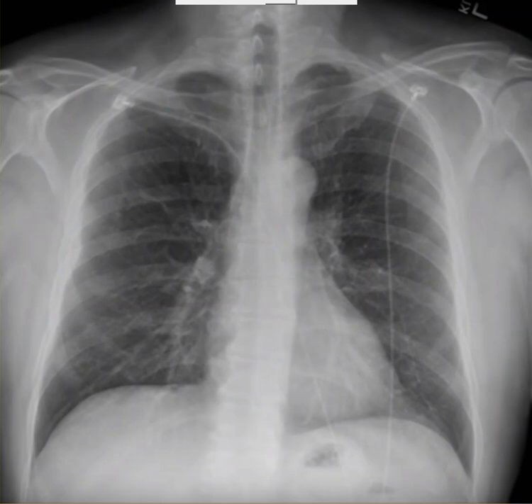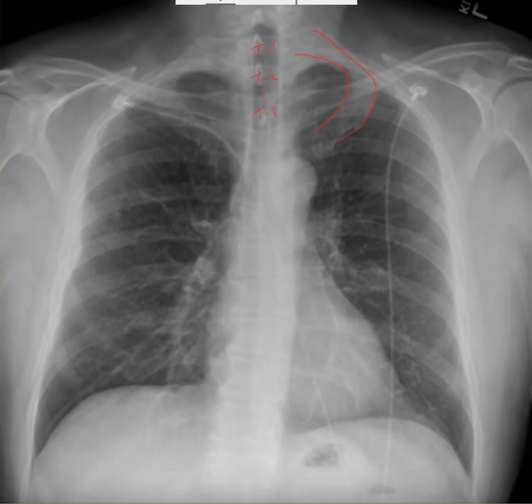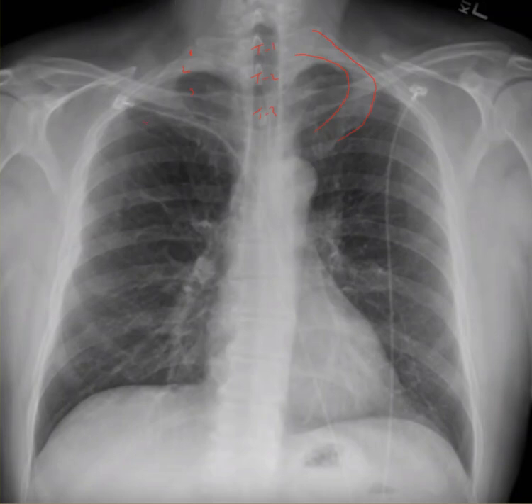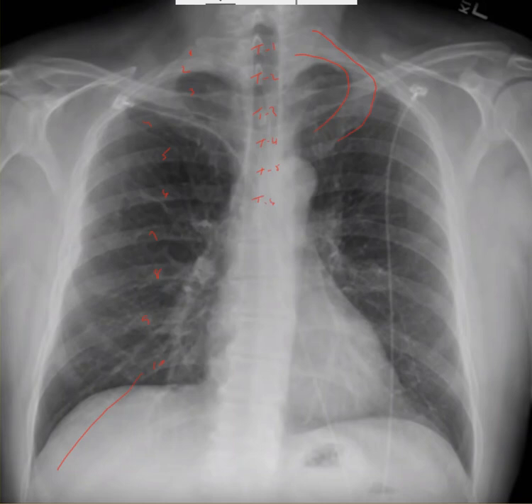Let's start with counting the ribs. You can see the first rib coming like so, and this is the T1 vertebra, T2, T3 — you can see they match up with the ribs. Here's the first rib on the other side, second rib, and then third, fourth, fifth, sixth, seventh, eighth, ninth, tenth. You can see the tenth one gets buried by the diaphragm, which is a mark of a good technical quality film. T4, T5, T6 — and you can see the carina is about T6 on this film.